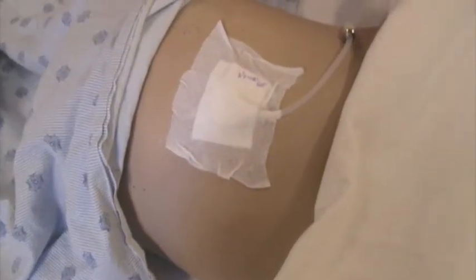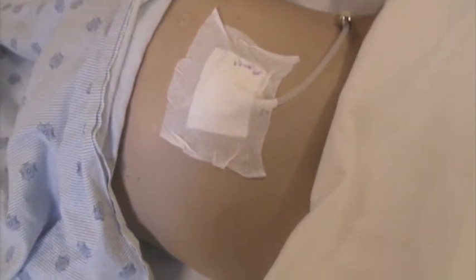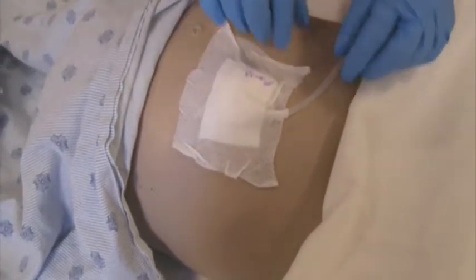Have your patient in a comfortable position that will allow for access to the PD catheter. Continue with a thorough hand wash. Apply clean gloves and remove the old dressing.